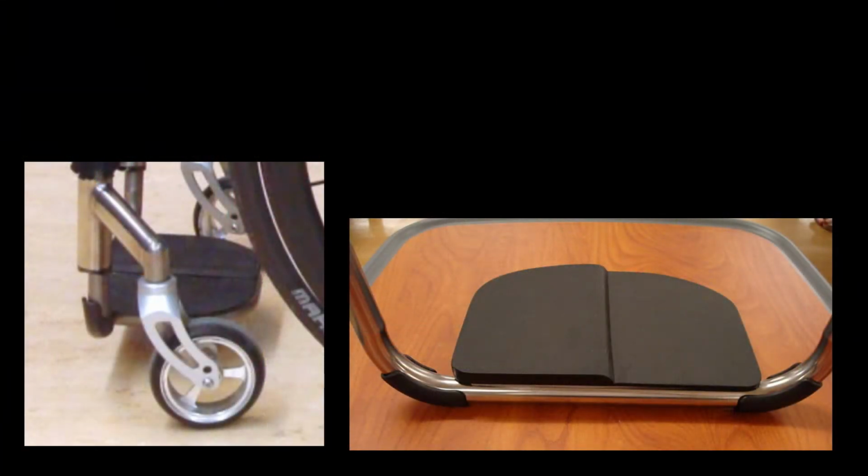So what I did was I found this little Invacare fork in the back room. It looked like, oh, this might be able to work, and I took my stem stud and backed it out a little bit, and I put that soft roll caster on there, and without changing anything in my push technique or anything else, it was like it absorbed the impact, and it became much less of a problem. So I solved one thing there.